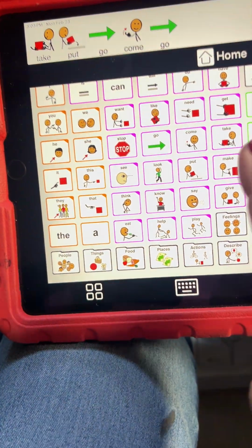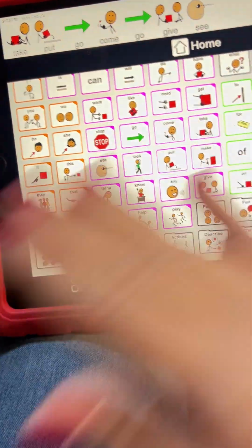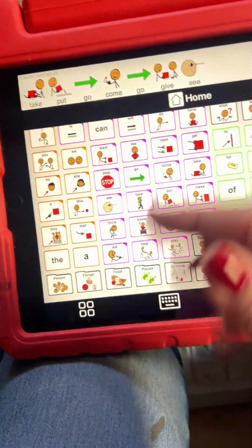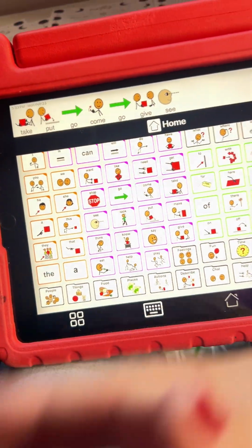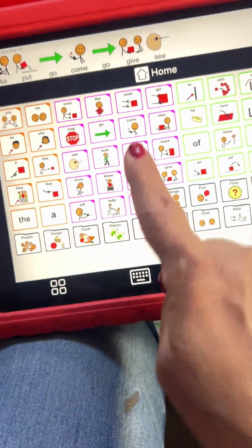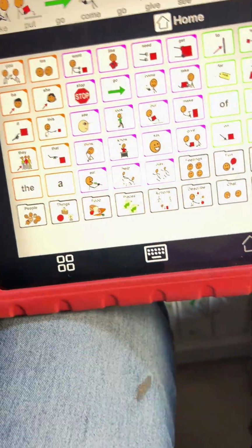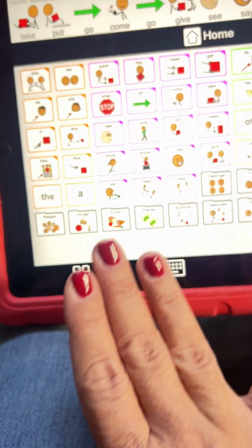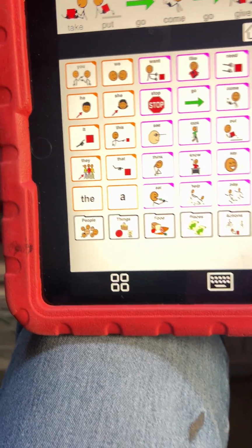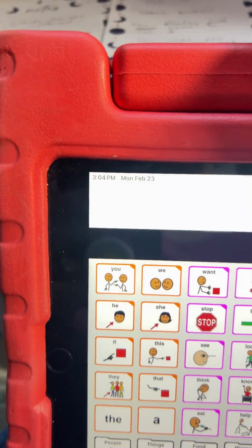And then I also had to train myself, so when they are pushing the wrong thing, not to correct, not to stop them, and not to pull their hand back. Because sometimes, when I was starting, I'd pull their hand back, like, no, not that one, try again. But we give them praise and compliments for just trying it. It does not have to be correct, because you will get there. This is just early exposure. The more consistent you are, the more you're modeling it, it will definitely come. So I just wanted to make sure that I covered those tips.